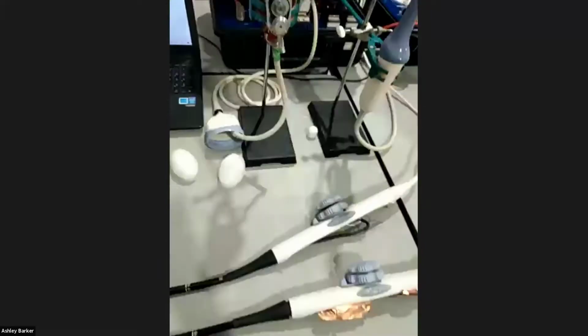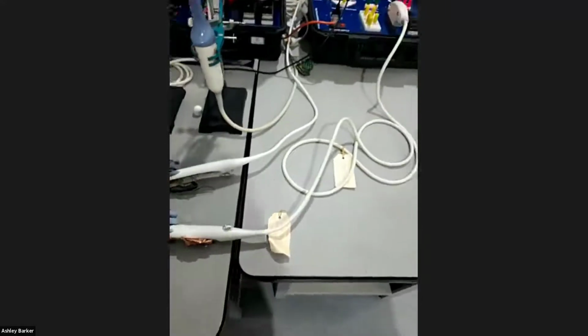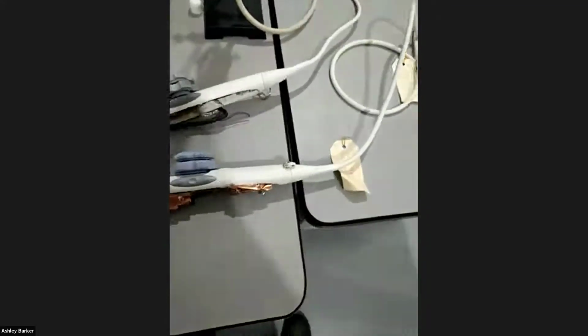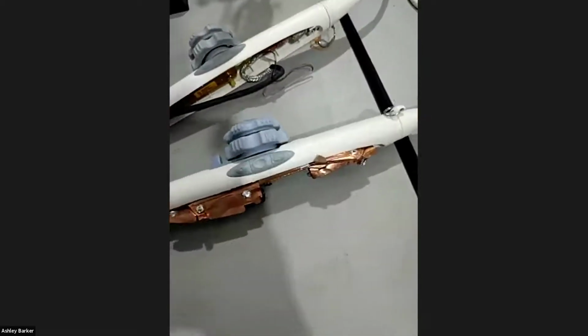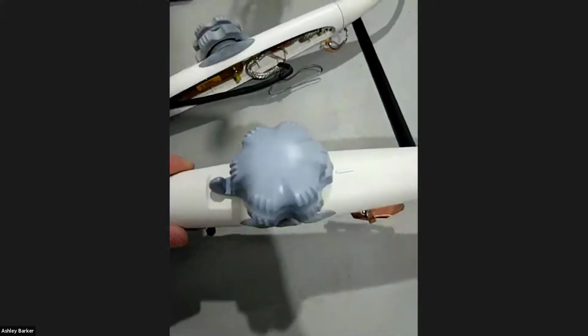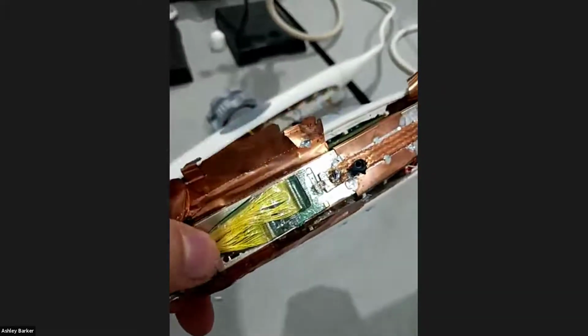Probably the next thing to show you is a TE probe. I'm sure maybe you don't do a lot of them, but you're ultrasound, so let's all get exposed. So a transesophageal probe, which I'm sure you've seen. I've pulled it apart and you can start to see there's a fair bit of electronics in that control handle. There's all the element wires that go straight down.